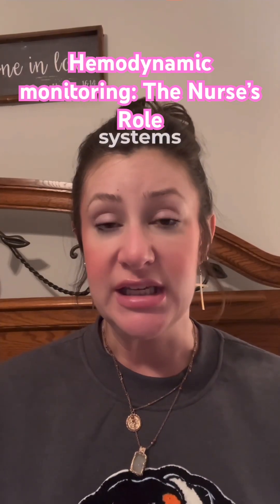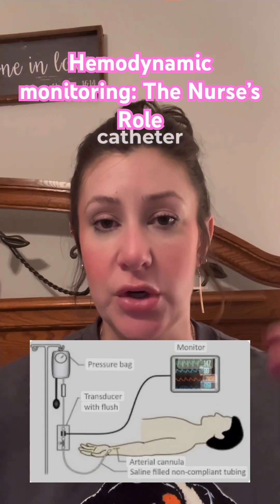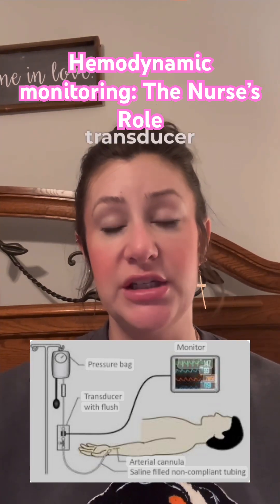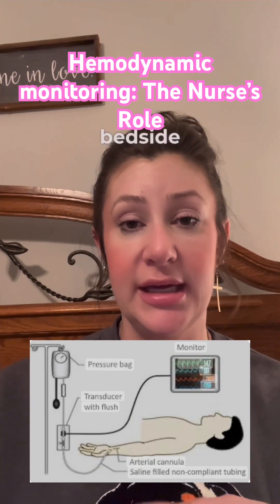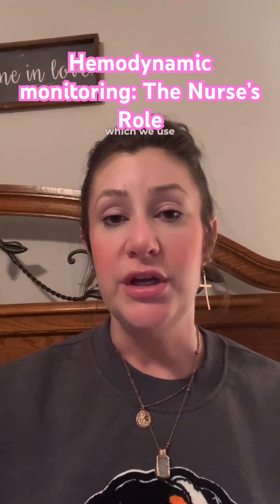All of these invasive monitoring systems are going to have some basic components: invasive catheter, pressure tubing, and this is connected to your pressure bag, the transducer — it is the transducer that has to be leveled with that flebostatic axis — the flush system, and then the bedside monitor. There's also going to be a stopcock system.